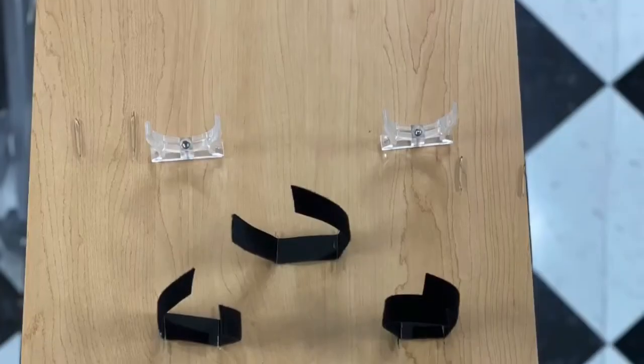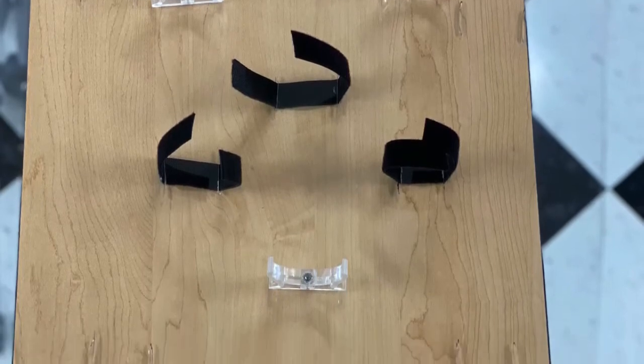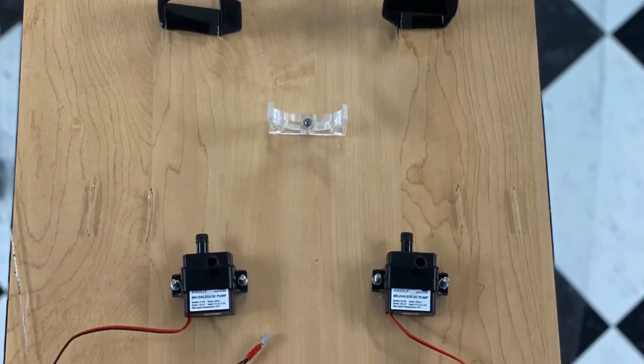This is the backing plate of the mannequin that all the parts will be attached to. The Velcro and the random notches are what will hold everything down, and the lower pumps are attached via metric screws and nuts.